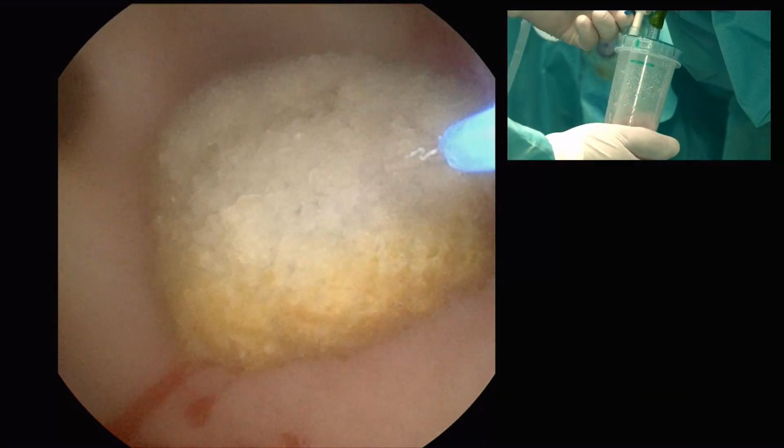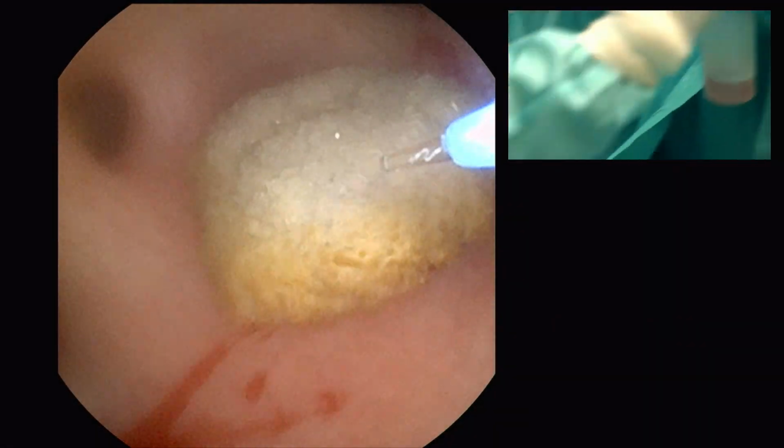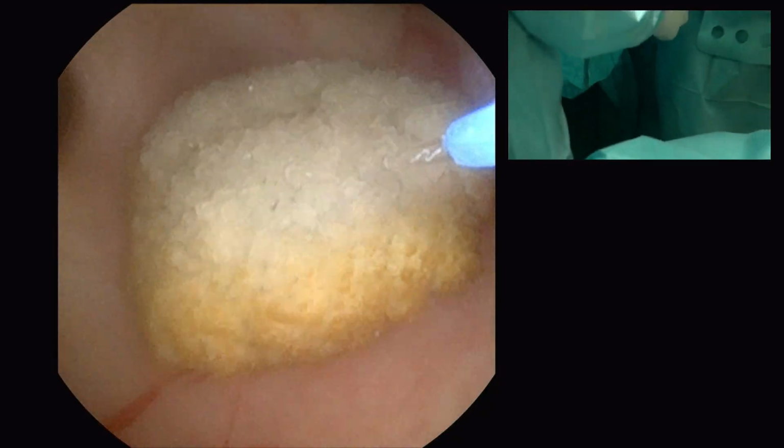Okay. So holmium should be used in the upper ureter or for ureteric stones, and what I recommend is that thulium be used in kidney stones only. Okay, dusting. Thank you. What are the settings?